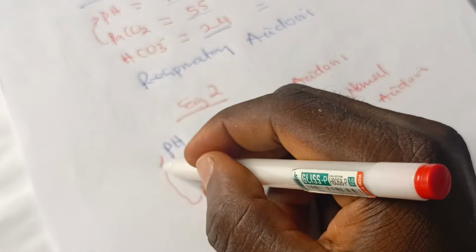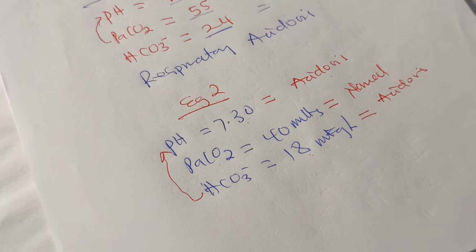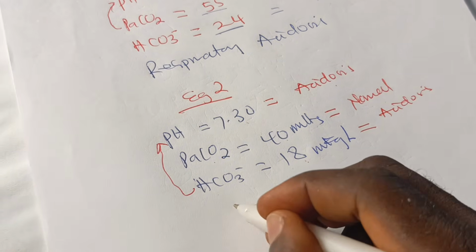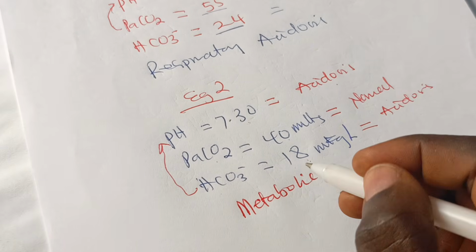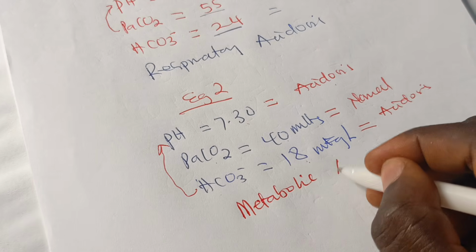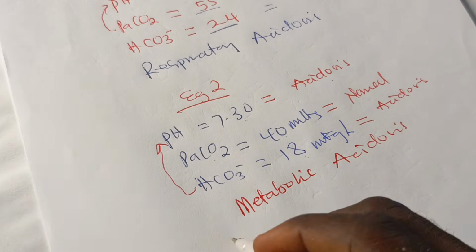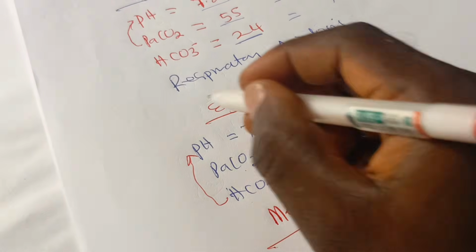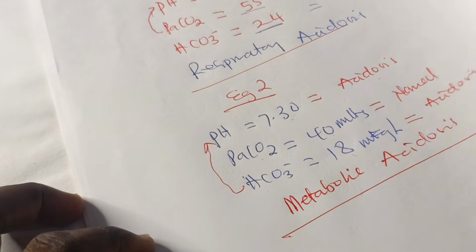Does it agree with the pH? Of course, it agrees. They are the same. They are moving in the same direction. Hence, this is what? Metabolic acidosis. Congratulations, you have gotten it.